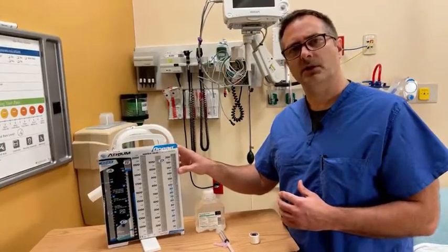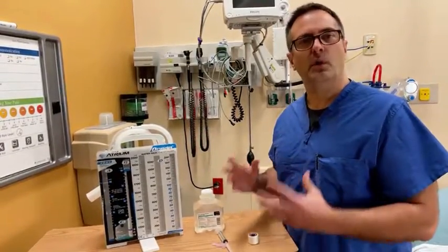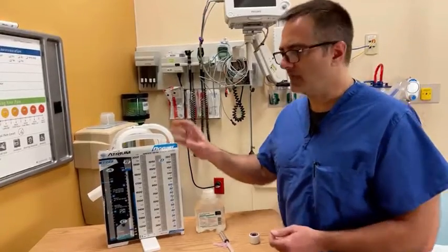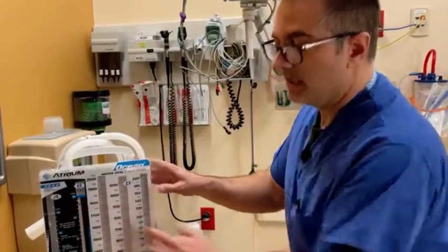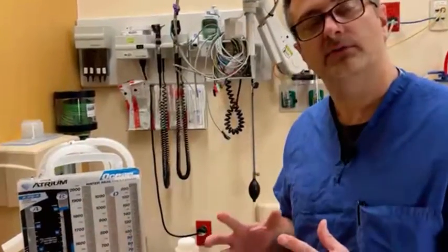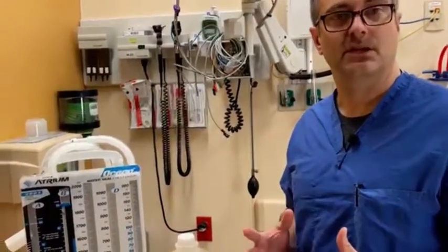And finally, the last chamber we'll look at here is our suction control chamber. Now there are a couple of different types of chest tube drainage systems on the market. This particular one is called a wet drain system. What that means is I have to actually instill water to fill it up to this 20 centimeter mark. It is that column of water that provides the amount of suction, negative 20 centimeters of suction.